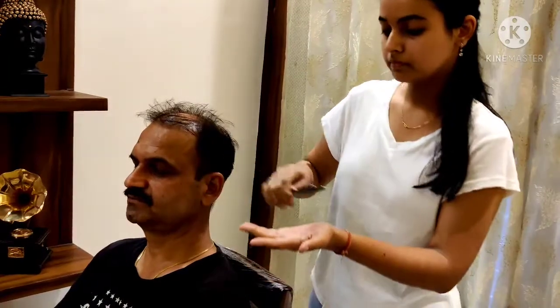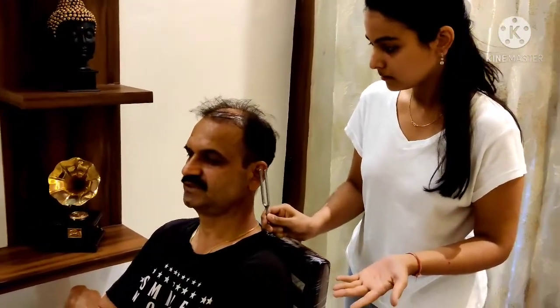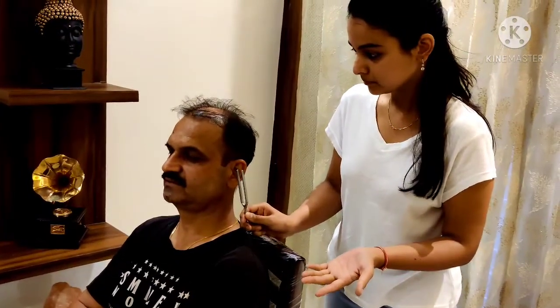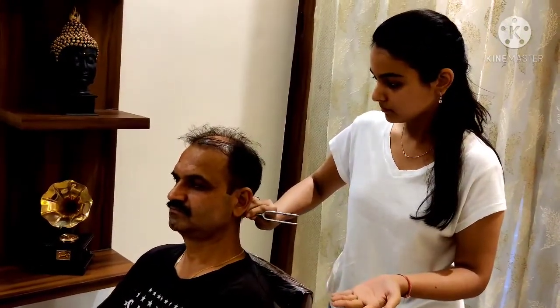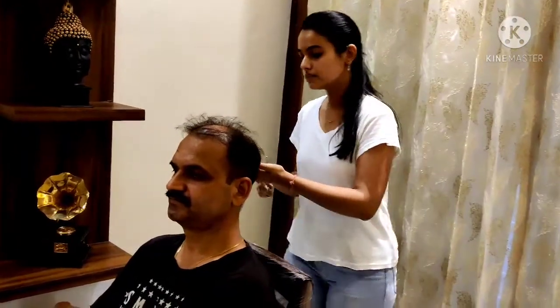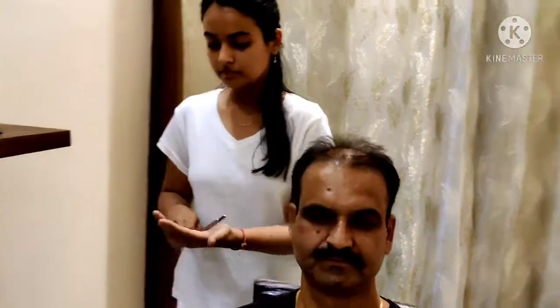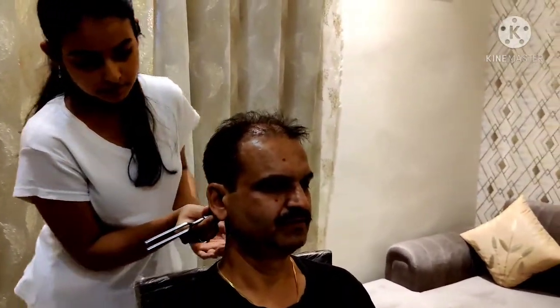Rinne test. Compare air conduction with bone conduction. Place the base of a lightly vibrating tuning fork on the mastoid bone behind the ear and level with the canal. When the patient can no longer hear the sound, quickly place the fork close to the ear canal and ask if the patient hears a vibration. Here the U of the fork should face forward, which maximizes the sound transmission for the patient. Normally the sound is heard longer through air conduction than through bone conduction. In conductive hearing loss, sound is heard through bone longer than through air. However, in sensorineural hearing loss, sound is heard longer through the air.